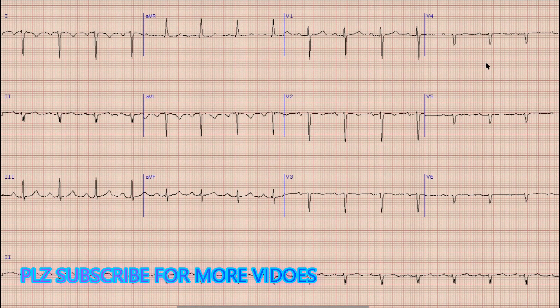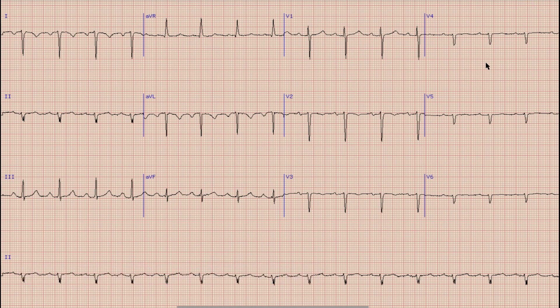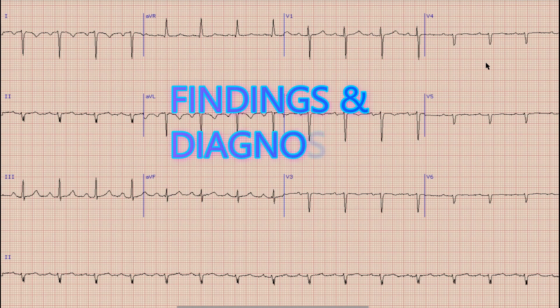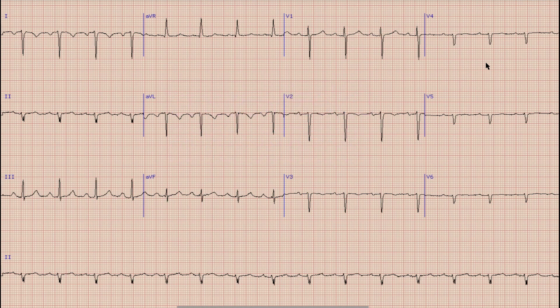This is the ECG which we are going to discuss today. Today's ECG is very interesting because of this finding we generally see in routine. As usual, before discussion starts, I would like you to pause your video, note down the findings and diagnosis yourself, and at the end of the video compare your findings with what was discussed.